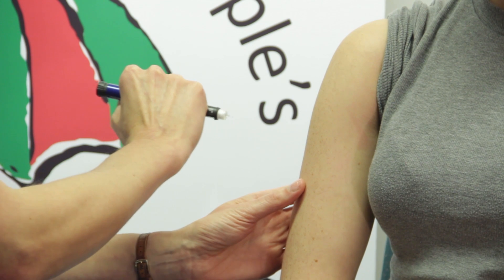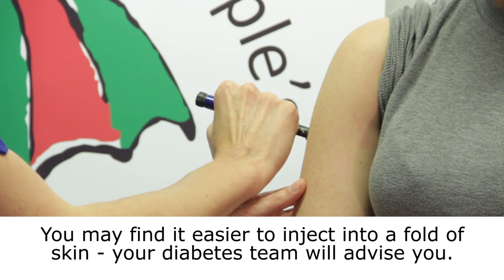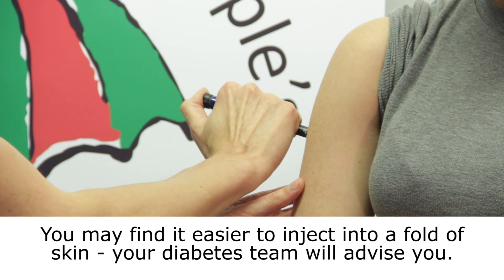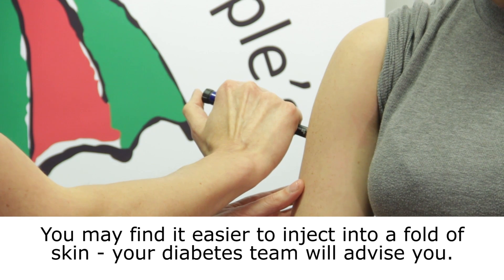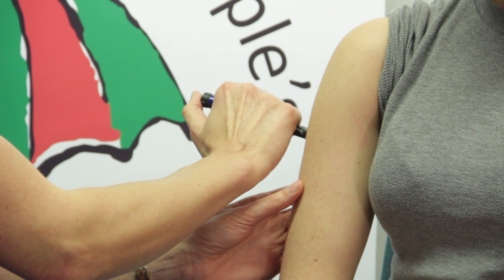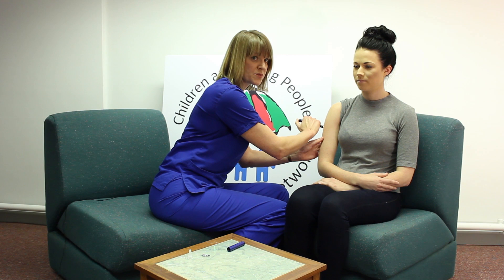You need to insert the needle at 90 degrees to the skin and push all of the needle into the skin. Once the needle is fully in the skin, you press the button down — that delivers the insulin — and the dosing dial will now read zero. You now count to ten seconds before you remove the needle from the skin.